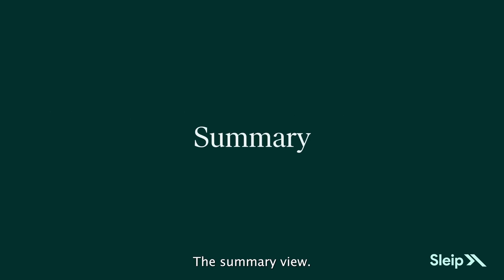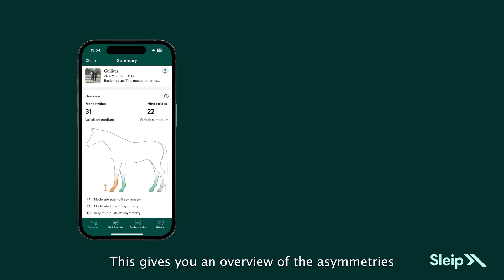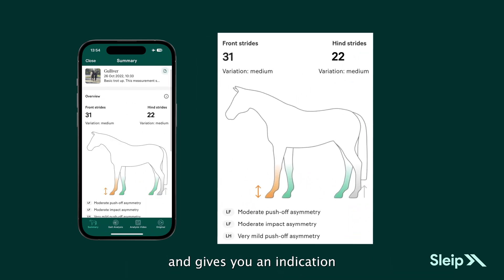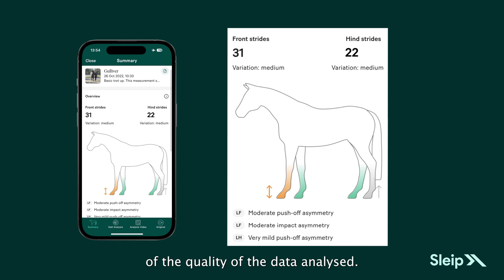The Summary View gives you an overview of the asymmetries detected during analysis and an indication of the quality of the data analyzed.